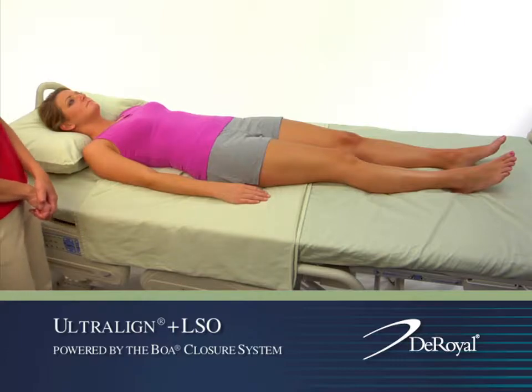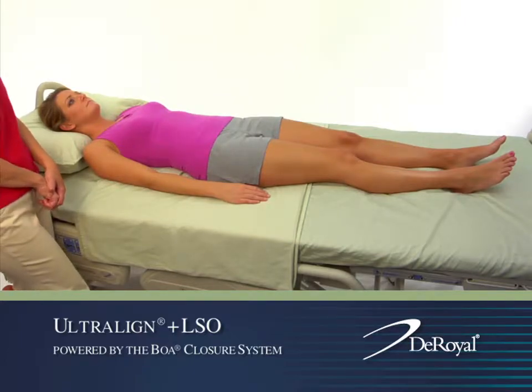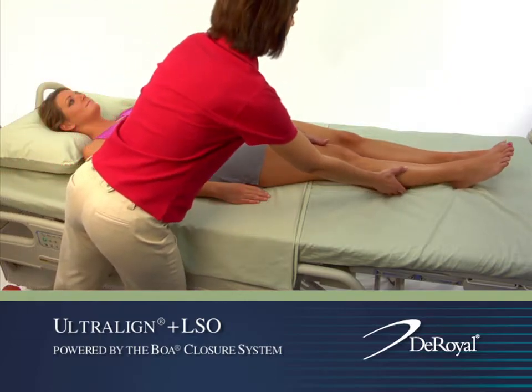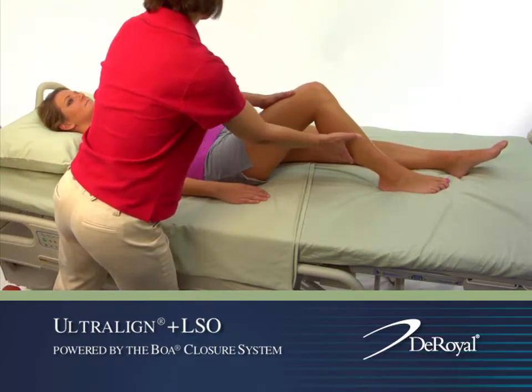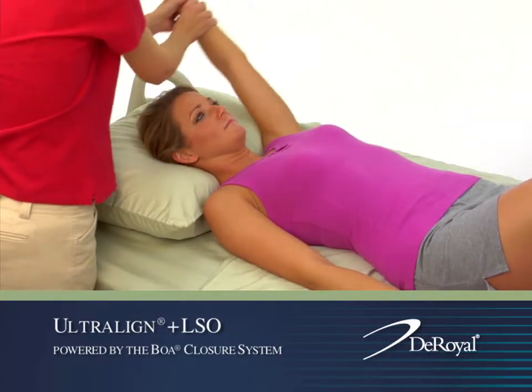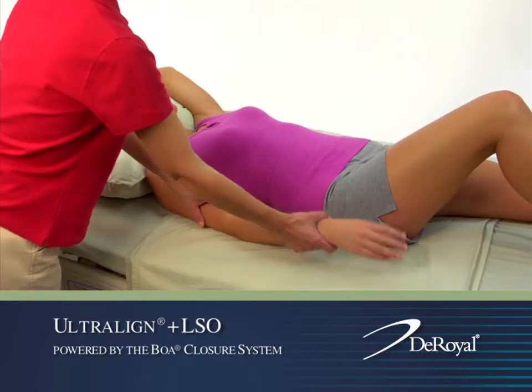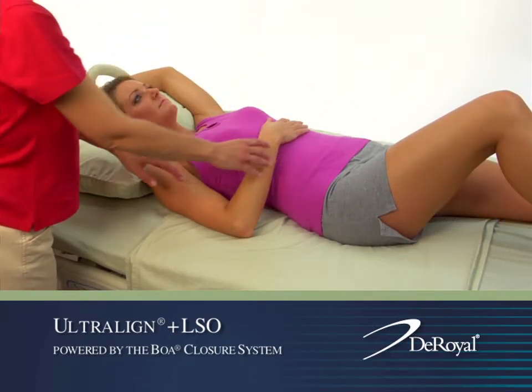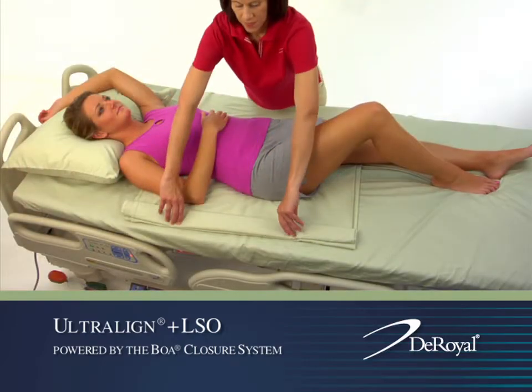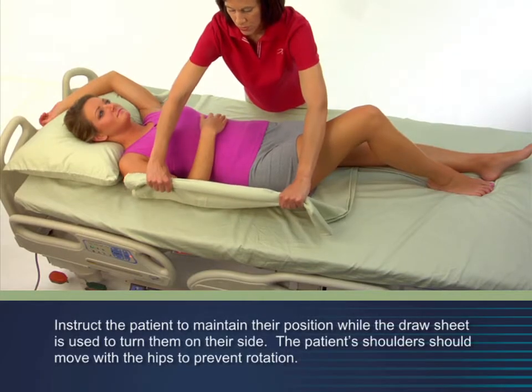To prepare for application, position the patient on their side. To do so, bend the knee of one leg to a 90 degree angle while keeping the other leg straight. Place the patient's arm overhead by their ear, and place the patient's other hand on their abdomen.